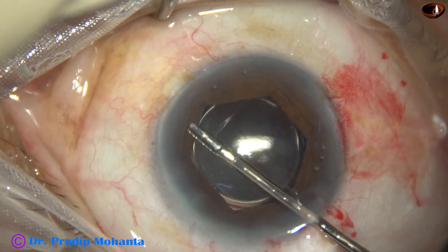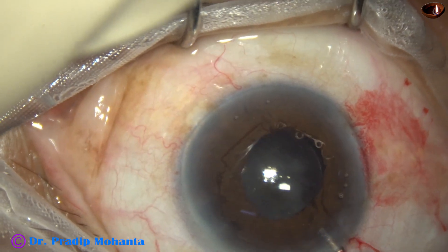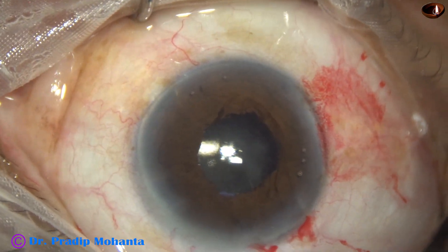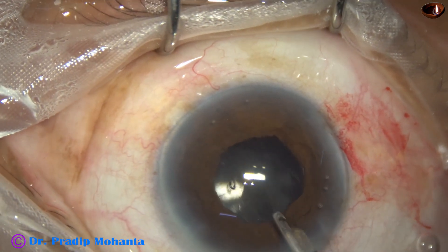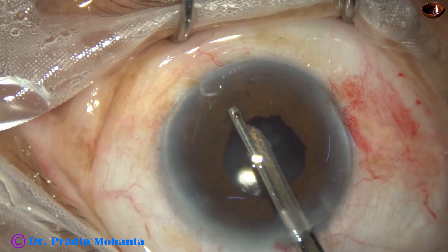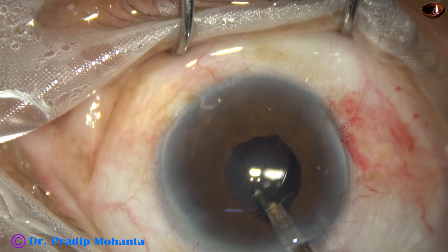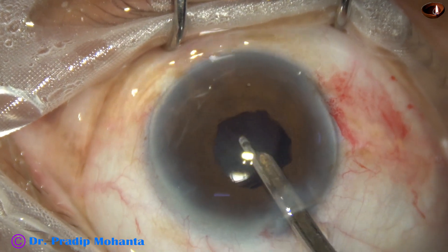Now is the time to remove the B-Hex ring. The B-Hex is disengaged and pulled out with the B-Hex forceps. Now is the time to remove the viscoelastic. I am using the Simcoe cannula, and now we can appreciate the sphincter tear.